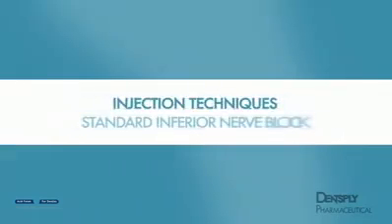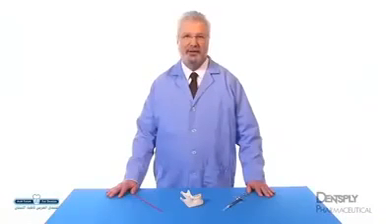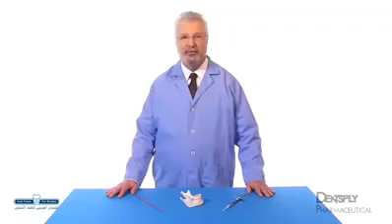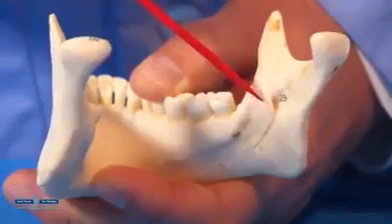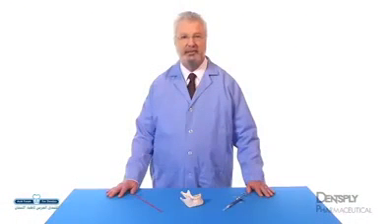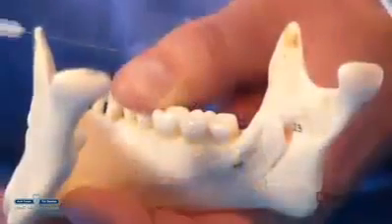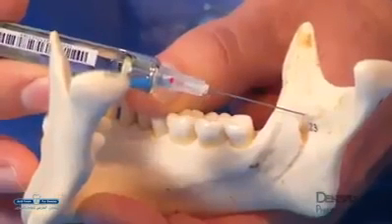Injection Techniques Part 1. A standard or classical inferior alveolar nerve block is used worldwide for producing mandibular anesthesia. The target for the inferior alveolar nerve block is the mandibular sulcus, just superior to the mandibular foramen and behind the lingula, a bony prominence on the ramus that anchors the anterior attachment of the sphenomandibular ligament. Deposition of anesthetic in this region will bathe the inferior nerve just before it enters the mandibular foramen.